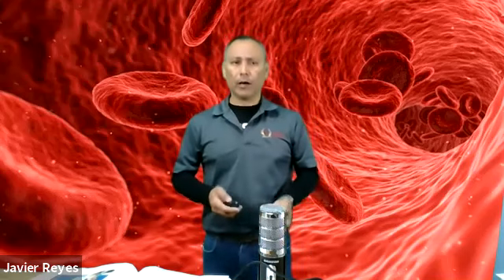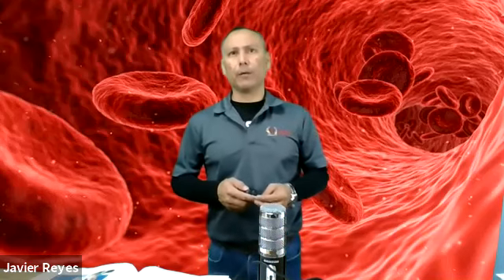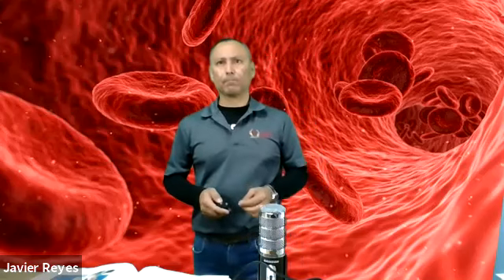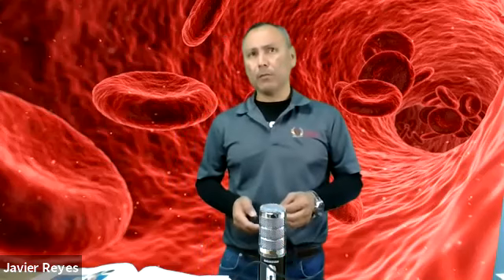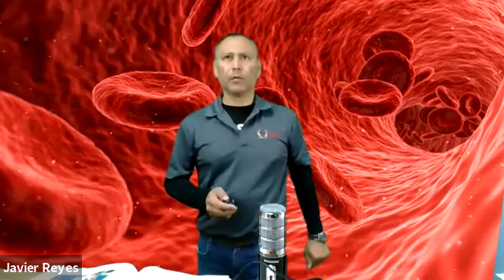They are colored just like your vacuum containers. So a lavender color means it has EDTA and so on. They have expiration dates, so make sure that you check your equipment before you use it. They should have markings for minimum and maximum fill levels so that you're able to collect the proper amount of specimen. There are other various presentations of these, and again, you're going to have to follow the order of draw.